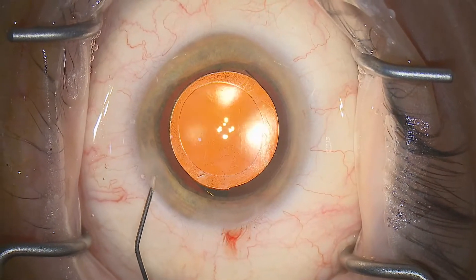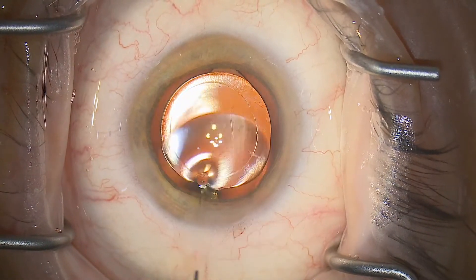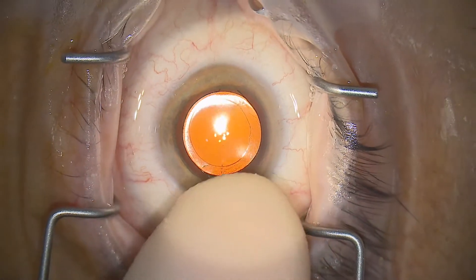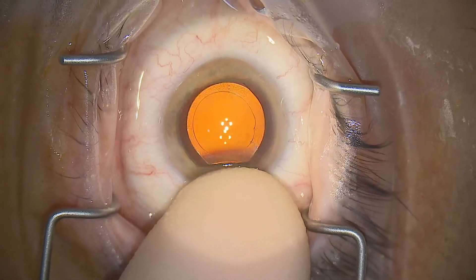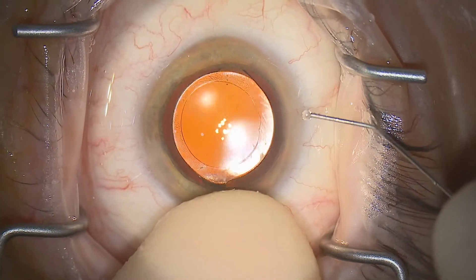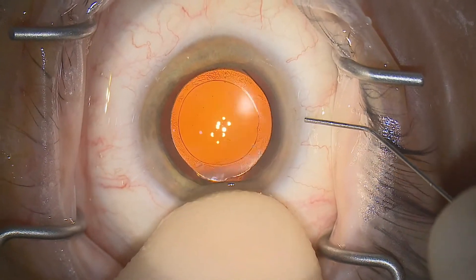This is done by floating just into the entry sites as we inject to fill the eye, checking the pressure is good with the index finger, waiting five seconds, checking again to make sure the fluid pressure is stable — it's in fact a little high here — and then floating a little further into the paracentesis for controlled outflow of fluid.